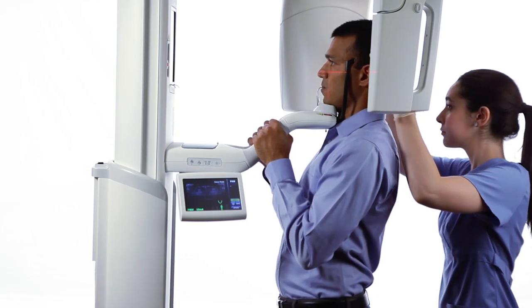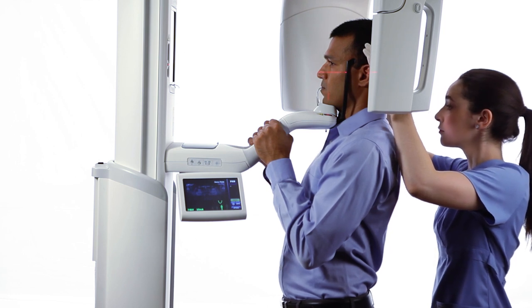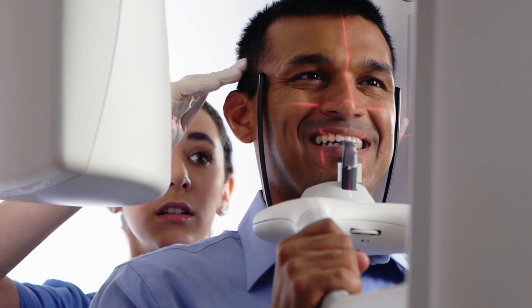Move directly behind the patient and gently rotate their head to align with the projected mid-sagittal laser. Be sure to observe alignment from front to back as well as from top to bottom.